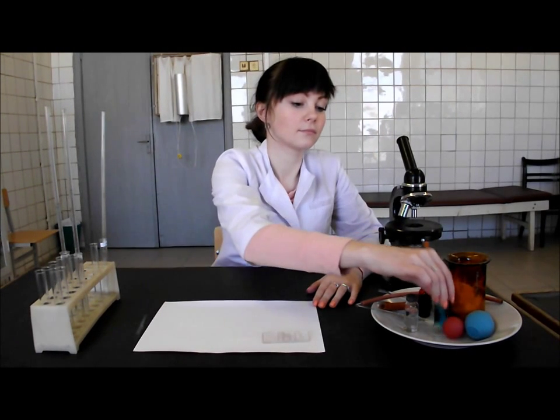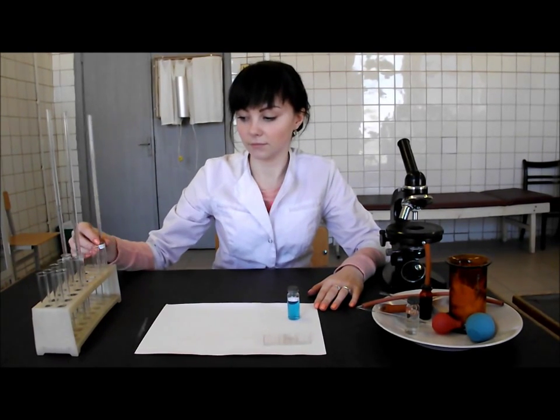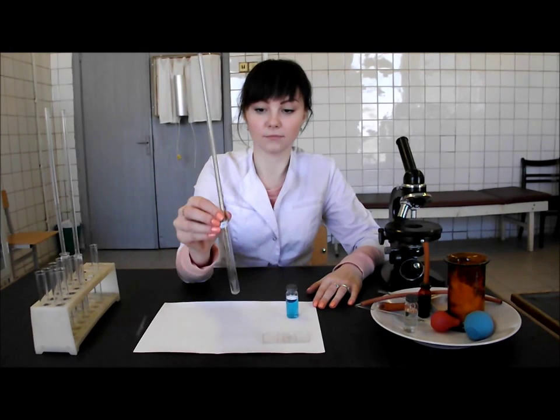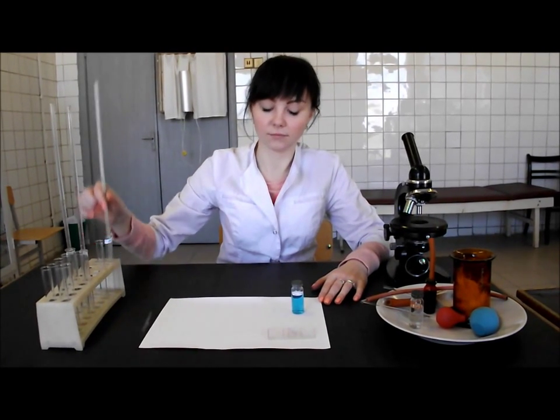Put 0.4 mL of 5% solution of acetic acid into the test tube with the help of the pipette, and put the solution on the bottom of the test tube.